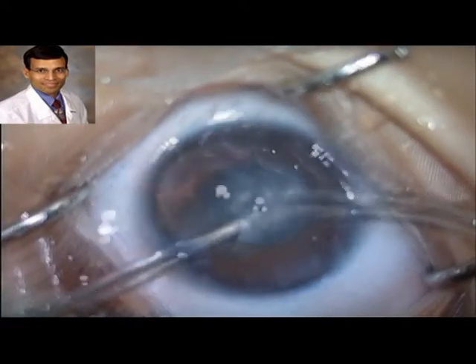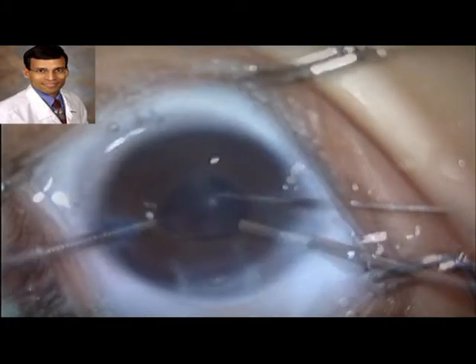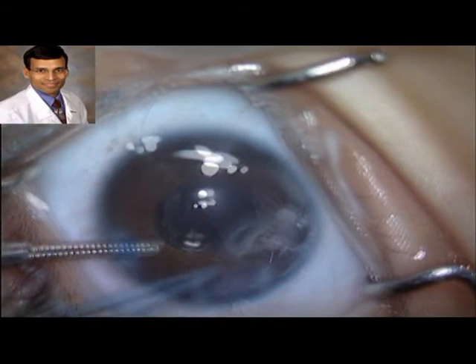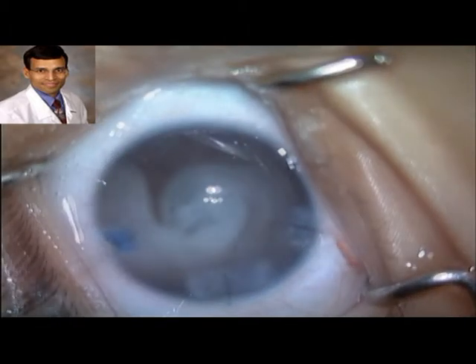After removing the cataract, a posterior capsulectomy and anterior vitrectomy were performed. Intracameral triamcinolone was injected to check for any vitreous in the anterior chamber and to provide some post-operative anti-inflammatory effect.